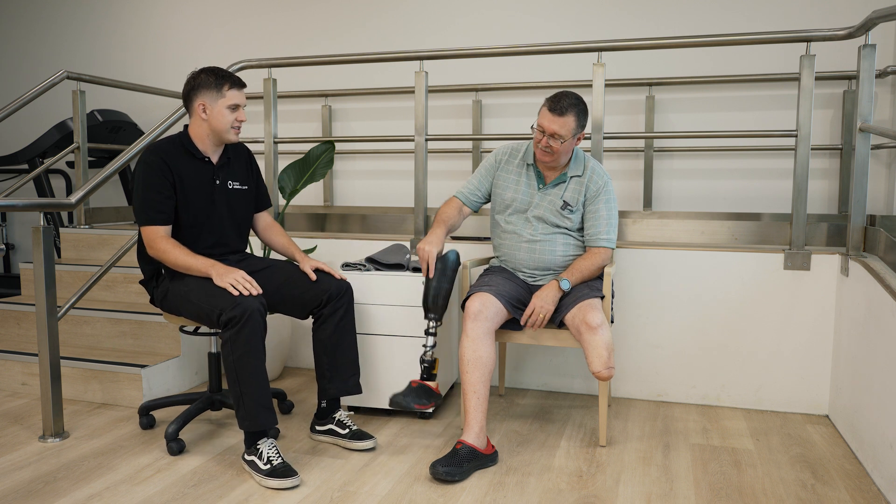Some prostheses utilize a one-way valve and a suspension sleeve to create a vacuum within the socket. Guy, can I please get you to demonstrate putting on a new prosthetic sleeve on your prosthesis for me?